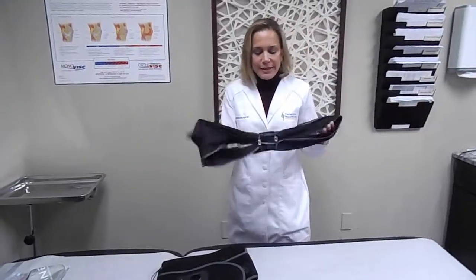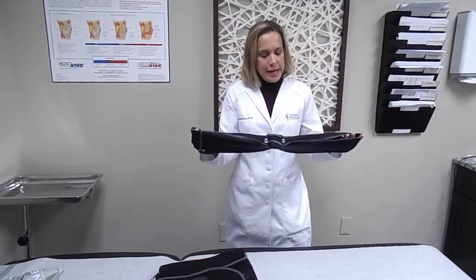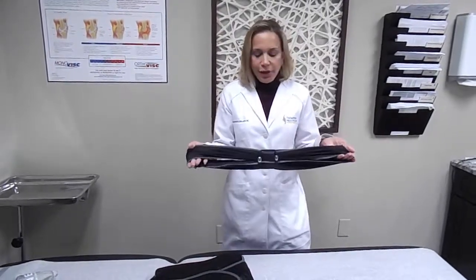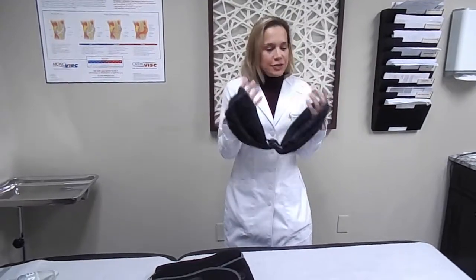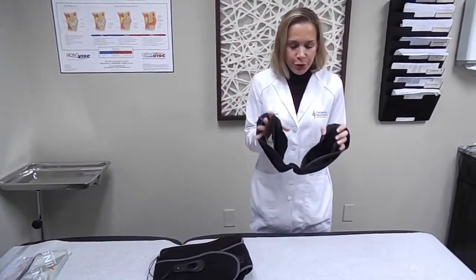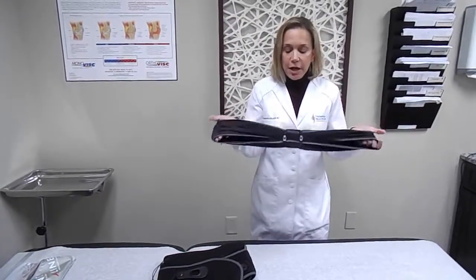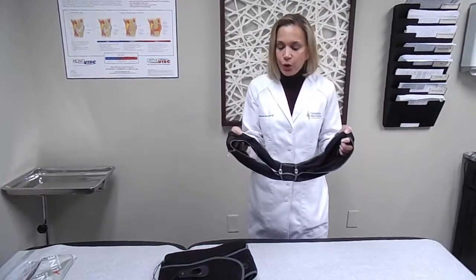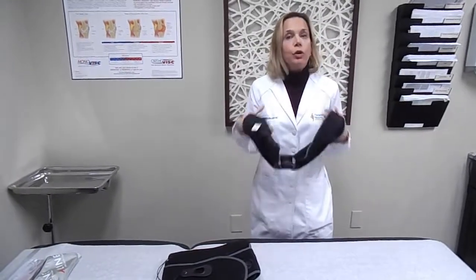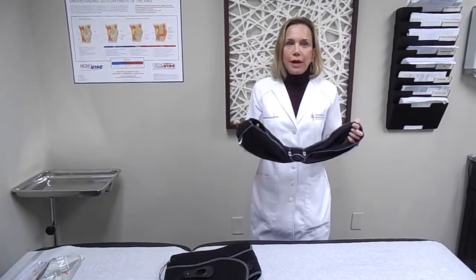Next, I'd like to touch base on the posture brace. The posture brace is an orthotic that can help with your posture. Lots of times we look at our phones, lean over at the computer, and that puts a lot of strain on the neck muscles. This brace, which is very soft and pliable and quite comfortable, helps pull your shoulders back and help you maintain correct alignment.